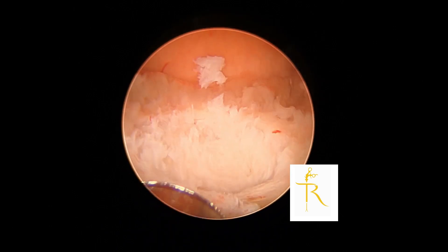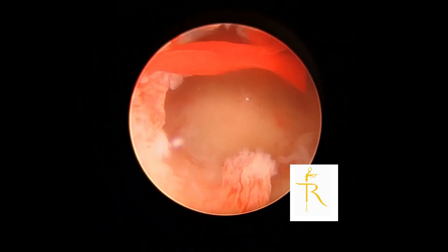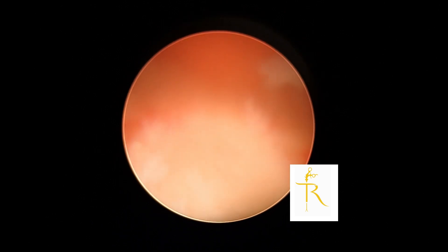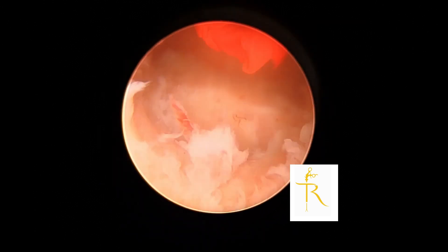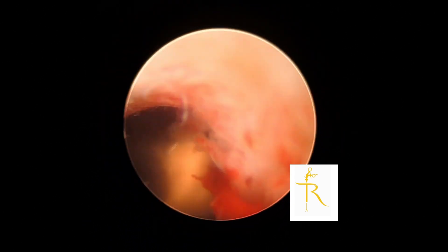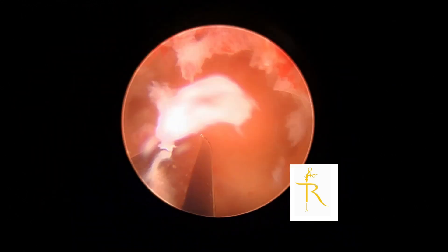We further resect the fibroid as much as possible. In this setup we can actually reduce the pressure — I'm at around 90 to 100 millimeters of mercury — just to see if the fibroid will pop back into the cavity. But as you can see, when you reduce the pressure the clarity and visualization of the fibroid is a bit reduced, so you increase the pressure again to see better.